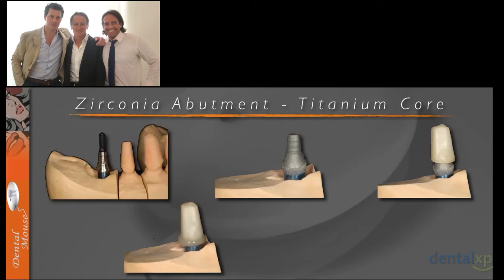After that, you treat them with Rocatec. So details are important. You take out the voids, and at the end you refine your abutment. This protocol step is not that difficult, but it has to be done in order to have fewer mistakes, a better prognosis, and a better follow-up at the end of the case.